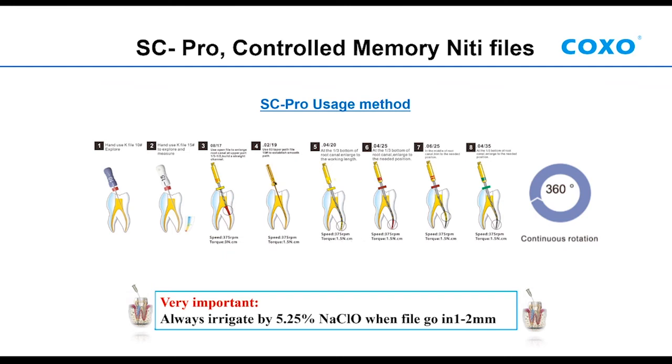And remember, I must remind you, every time you need to do irrigation. Irrigation is very important.